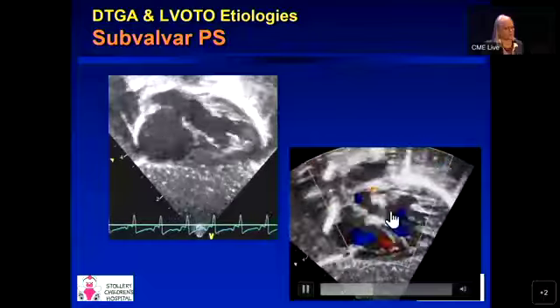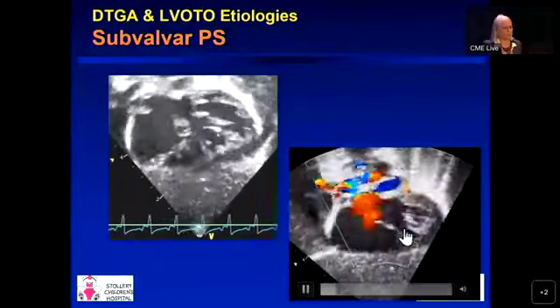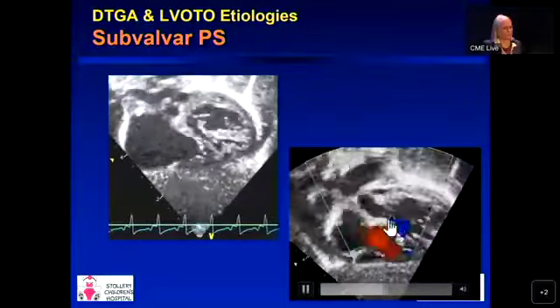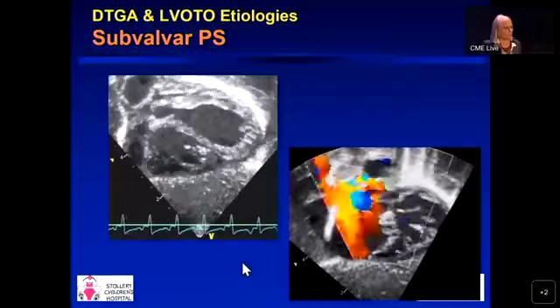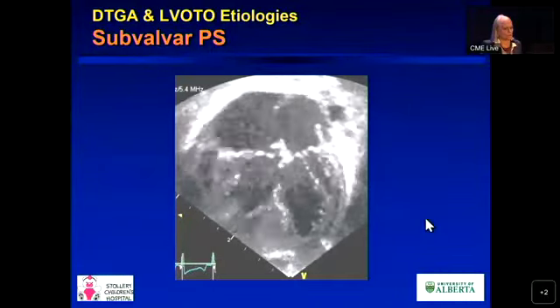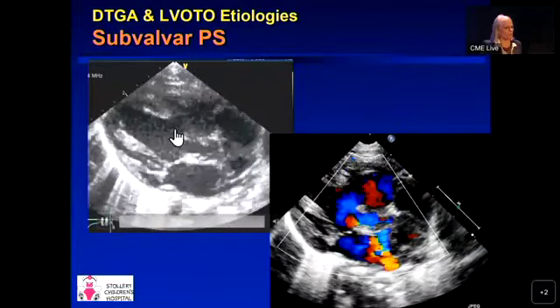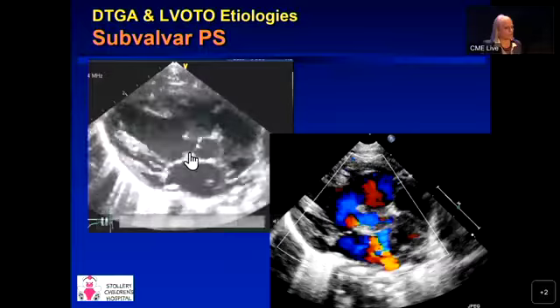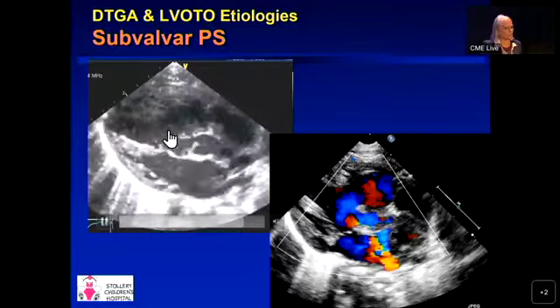You can see that there's going to be some narrowing of the subpulmonary area, but this VSD, there's a huge anterior muscular VSD as well as a perimembranous defect, but the anterior muscular one, I'll show you, was quite tricky, and the one that really affected what they were going to do. Four chambers looked quite normal. But there you can see your posterior malalignment, your long axis, and the pulmonary valve is a little bit on the smaller side, but not so small. It's about 7 millimeters relative to about a 10, 11 millimeter aortic valve, but the VSD was quite big.